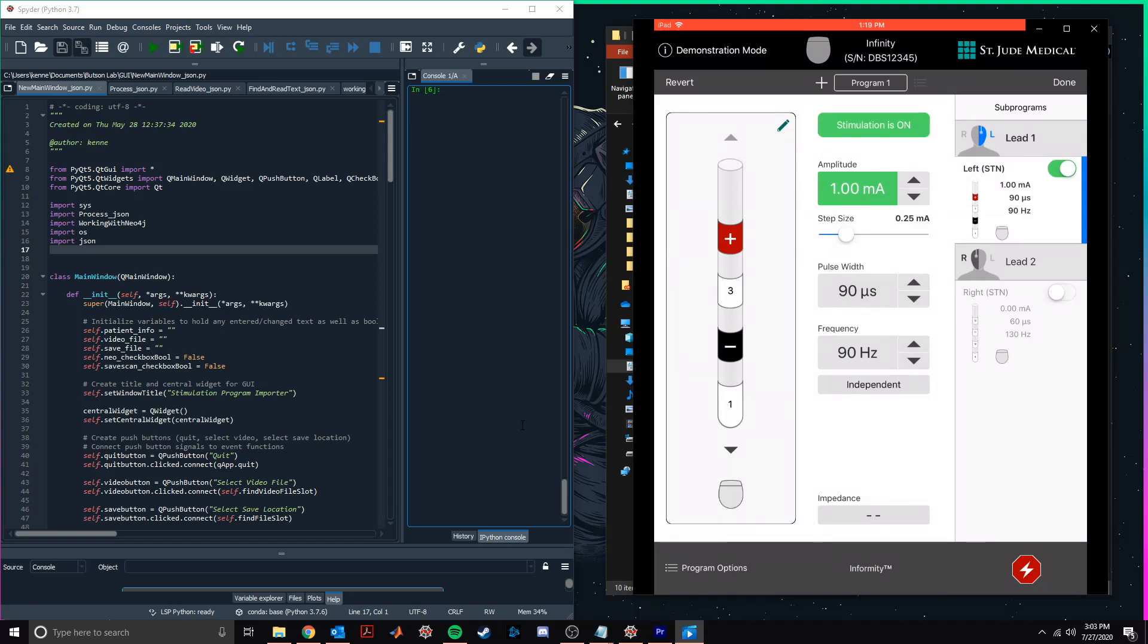The software will record information including IPG model, lead model, lead location, waveform parameters, electrode configuration, and impedance, among others.